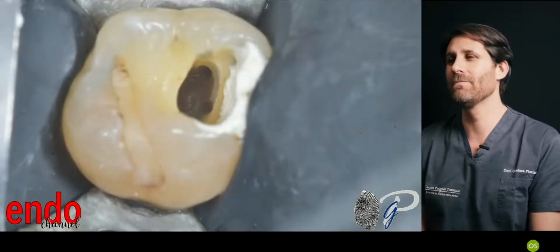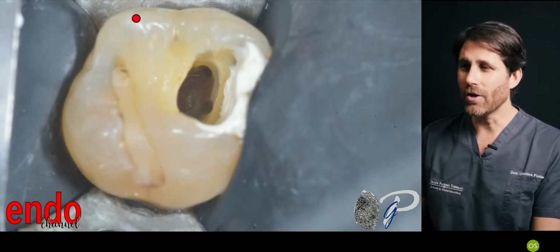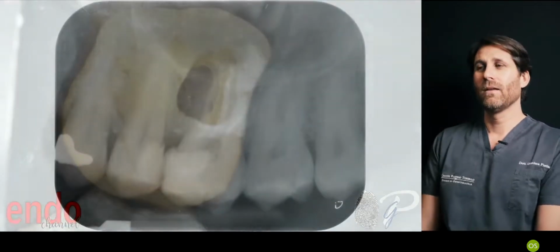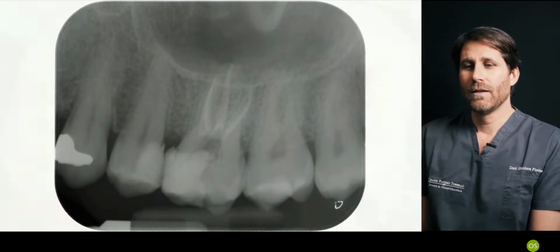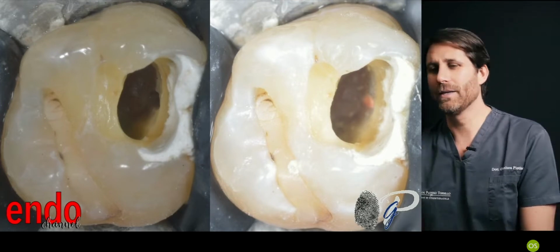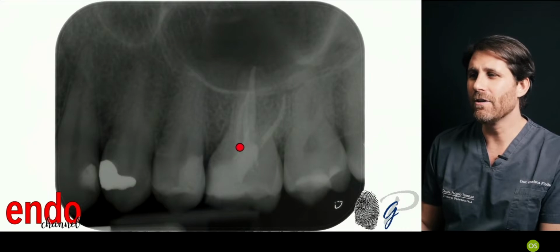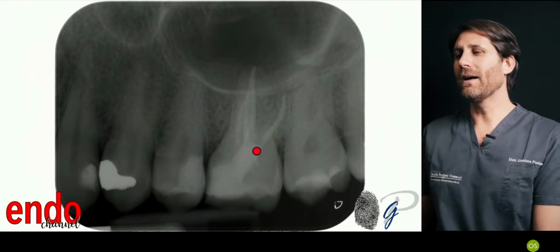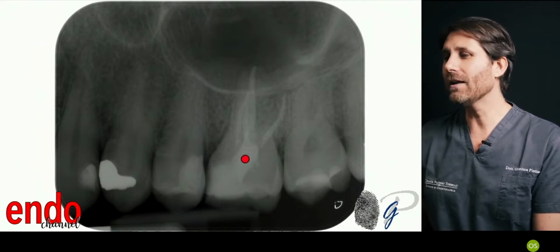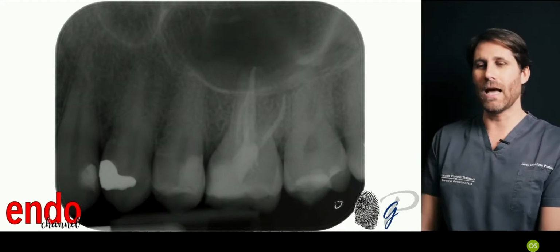And this is the clinical image, how we try to preserve the coronal tooth structure, the oblique ridge in the upper molars, treat all the root canals, even if difficult, and maintain as much coronal tooth structure as possible, especially the crucial pericervical dentin. And this is what we have already described very clearly: this mesialized access, the maintenance of the soffit, beveled occlusal enamel to permit the lights to go inside, removal of the restoration, and maintenance of the pericervical dentin in the mesial aspect.